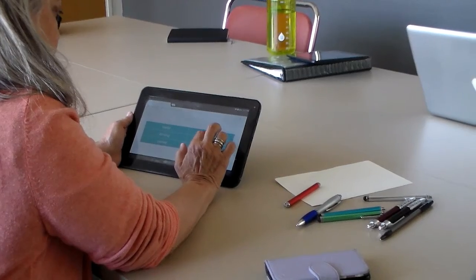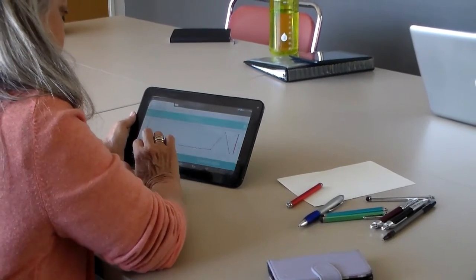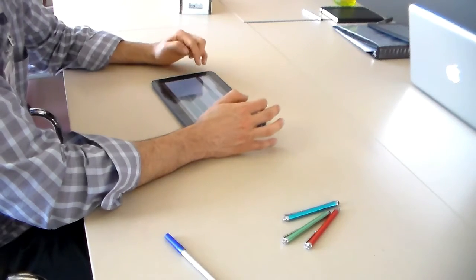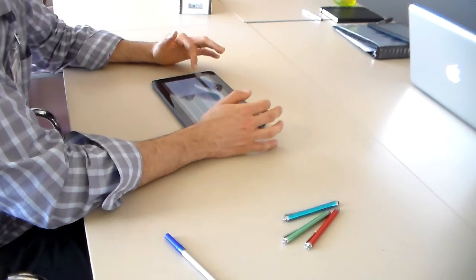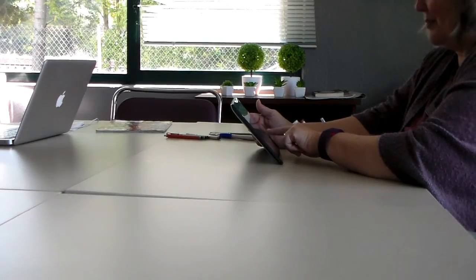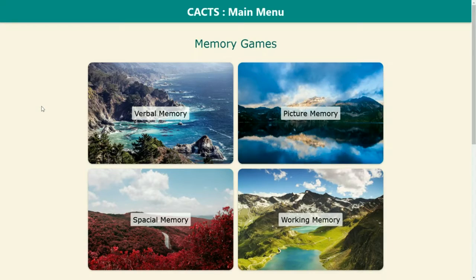We conducted a usability study with healthcare professionals at a local senior center to gauge the feasibility of using such a system within their facility. The results of the study seemed to indicate that, with some assistance and initial training, the system would be beneficial and easy to use by older adults and their caregivers. We will continue to improve the system's overall usability, accessibility, and functional capabilities with future studies.